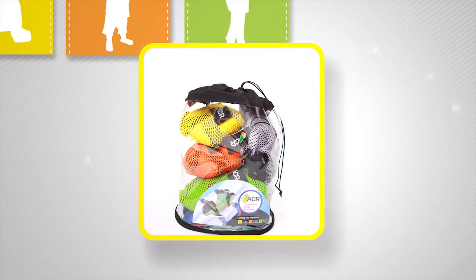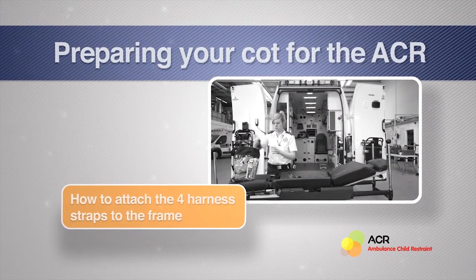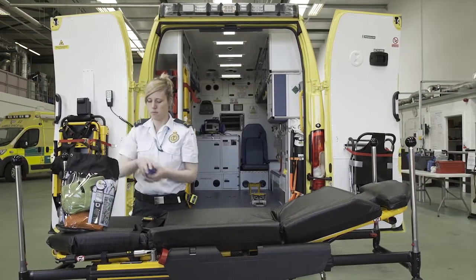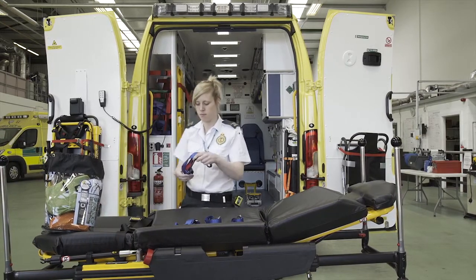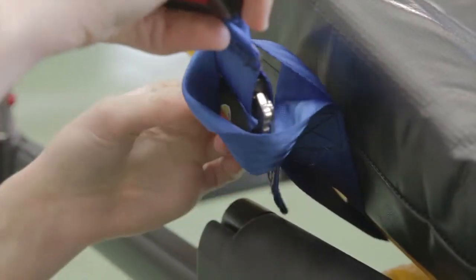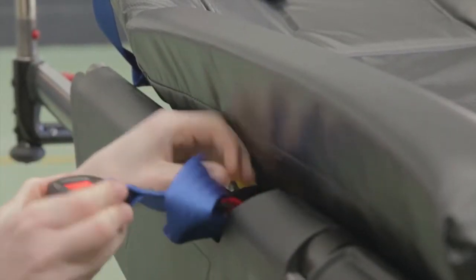Inside your ACR compact storage bag you will find the following items. The ACR is universally compatible with any cot. First, attach the blue harness straps to the cot frame. Pass the looped end around the frame. Repeat this so that all four harness straps are attached to the cot frame and resting on the mattress.